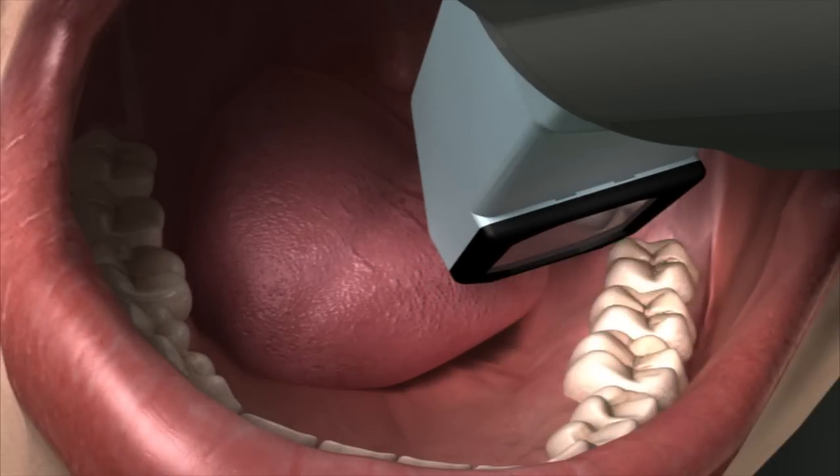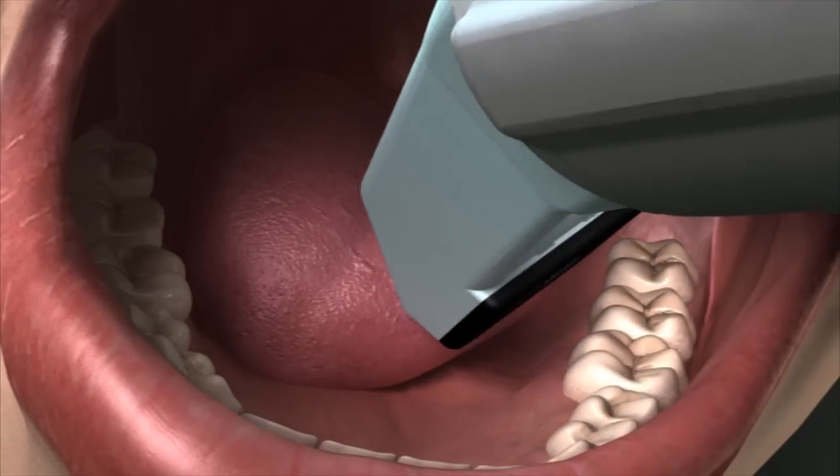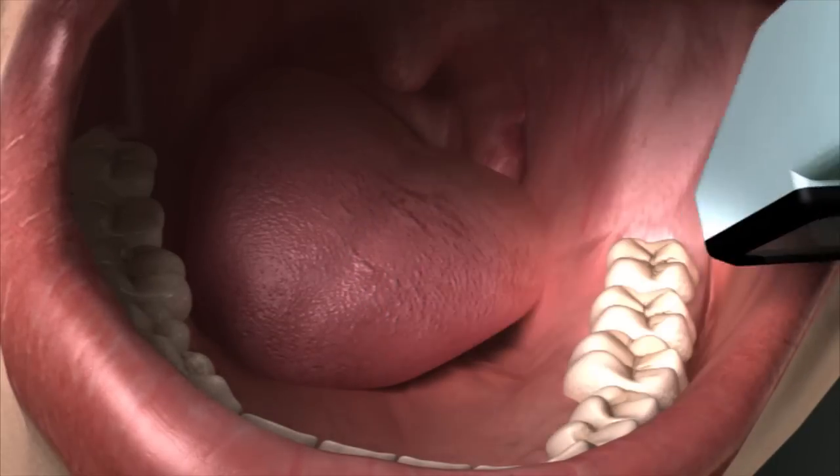After taking the scan, you will then move the wand one tooth mesial, being sure to include sufficient overlap in the two scans. This time, you'll twist the wand so the other side of the scanning surface is touching the tooth. Repeat this pattern until the entire lingual quadrant is scanned.